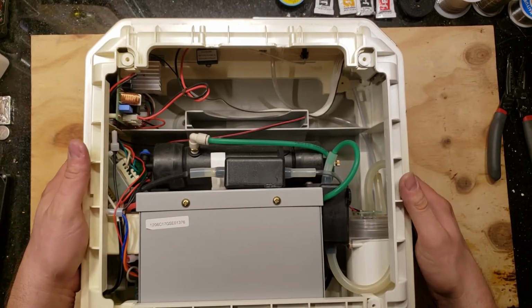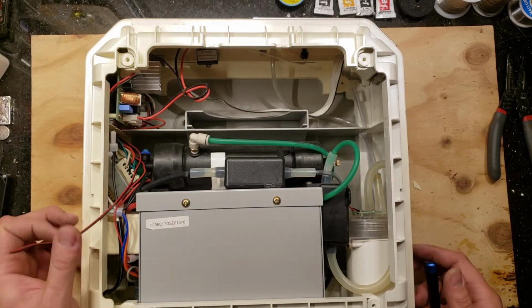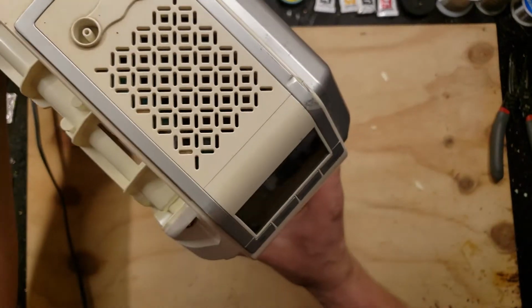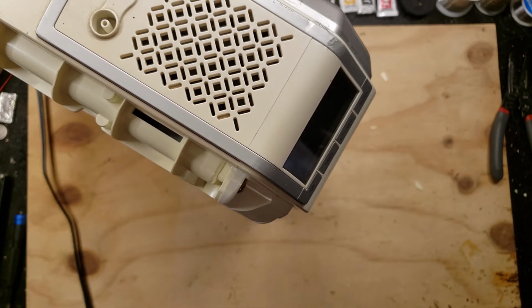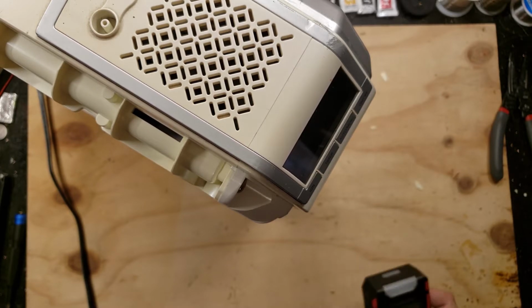Now, before we dig into it and take it apart, let's see if it actually works, if it does anything. The manufacturer's website says that it is supposed to output 30% oxygen, which would be a mild concentration. Our regular oxygen is what, about 20%. So let's see.